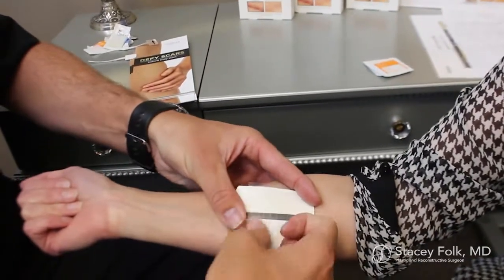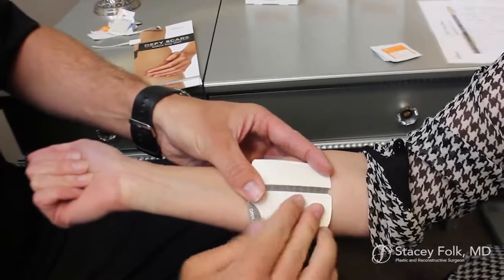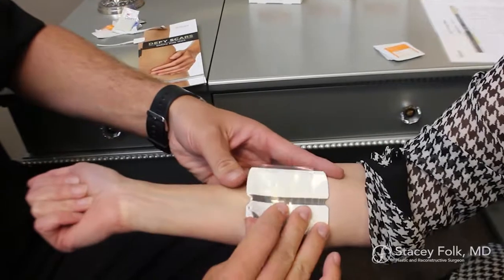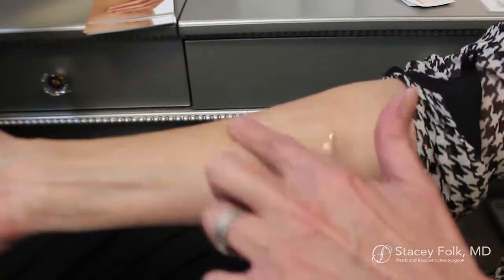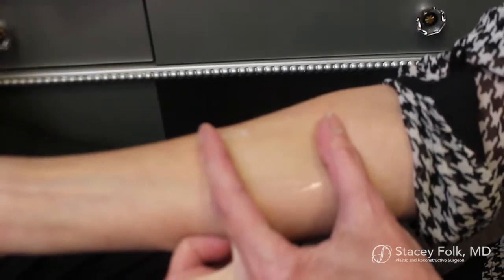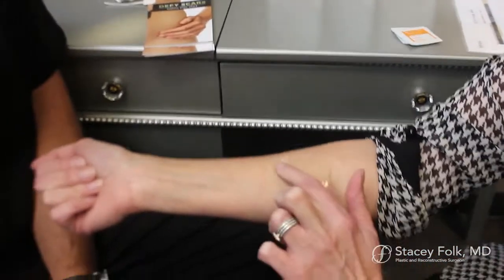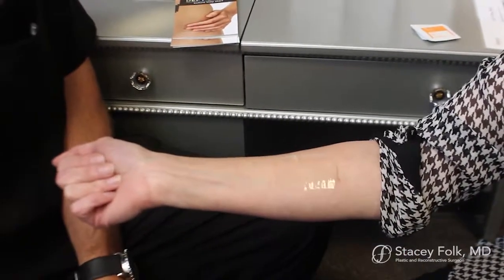You can use your thumbnail, you can use your palm of your hand. You just want to get a lot of nice adherence, and then you peel this away, and there it is right on my skin. This can stay on for about 10 days. If there is a lot of fluid accumulating underneath it, that means we were probably a little early and you might want to take it off.